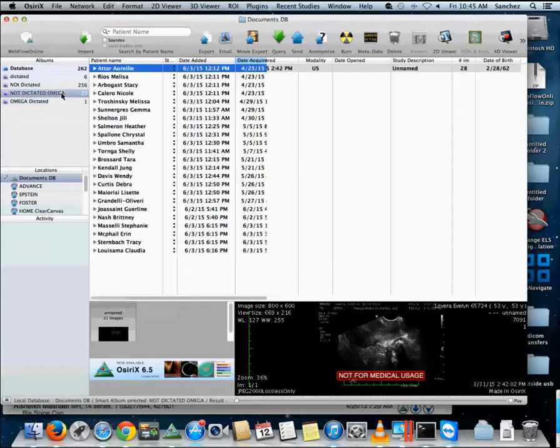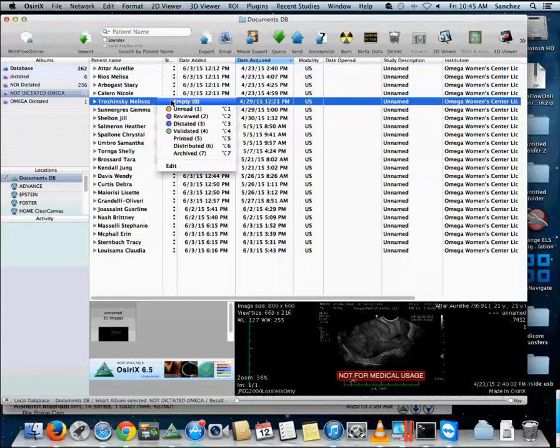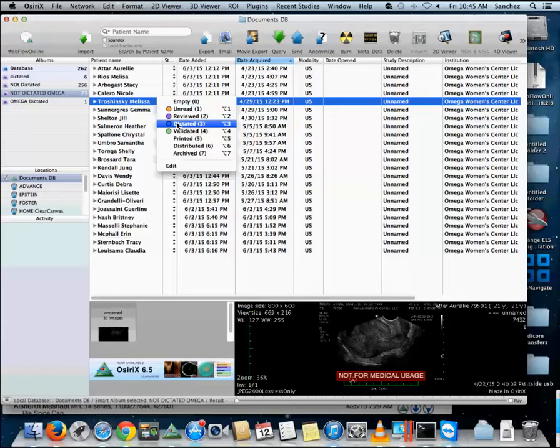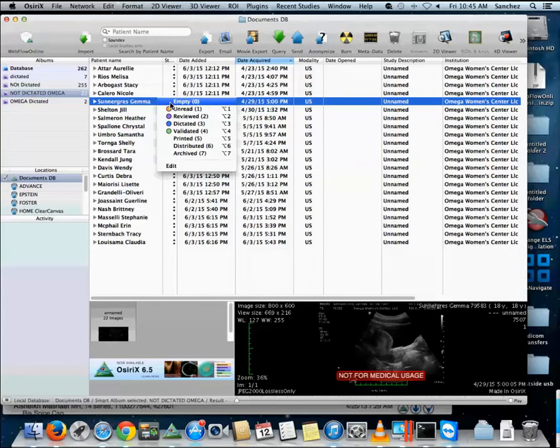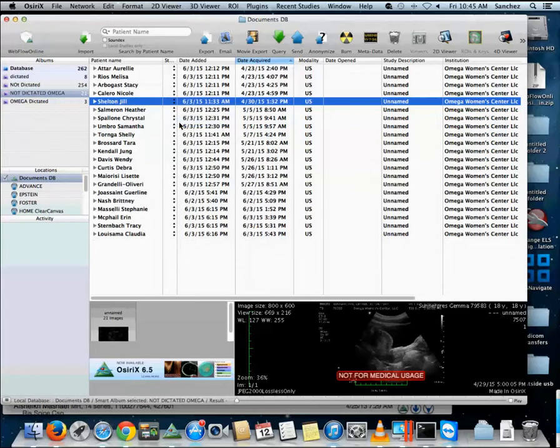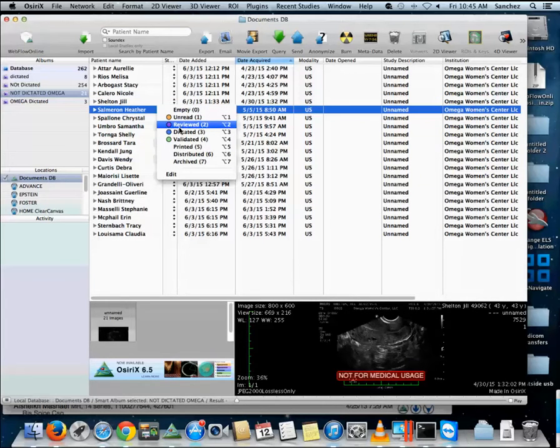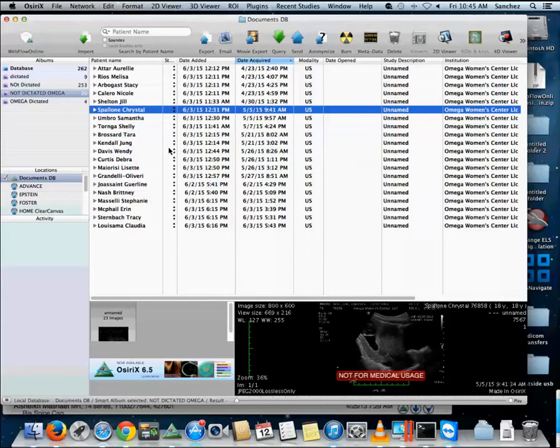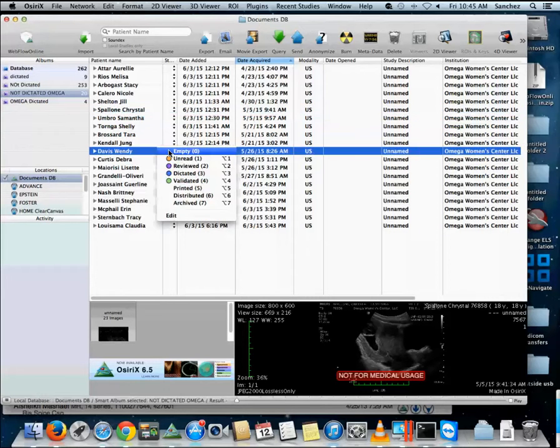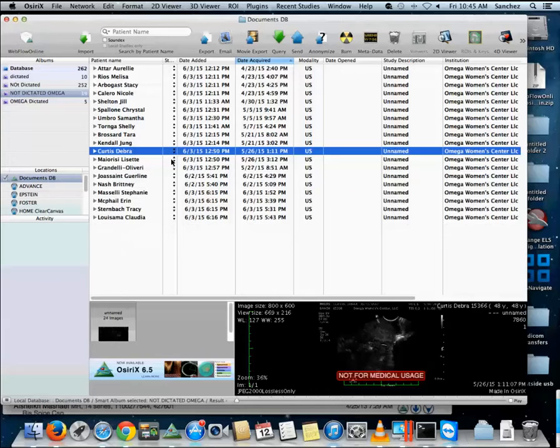So basically as I'm looking at this smart album, if I mark one of these studies dictated—the number's 23 right now—the number will then become 22. As you can see I can keep doing this and the studies will continue to disappear from this list. So the user basically works off a list like this, and as he dictates them he marks them dictated. The number count will go down and that's how he knows what studies he's read and what he has not read.